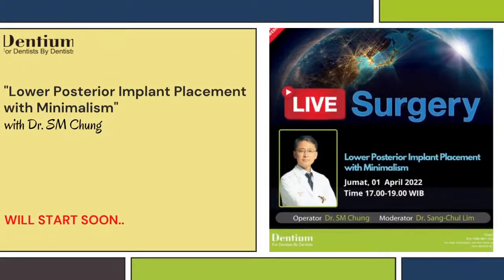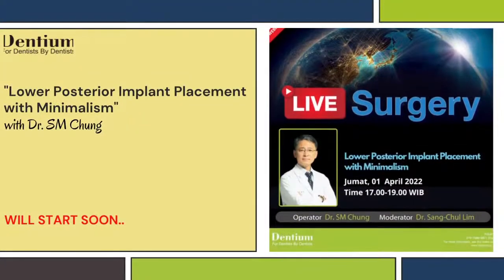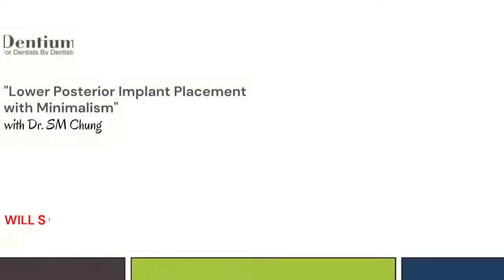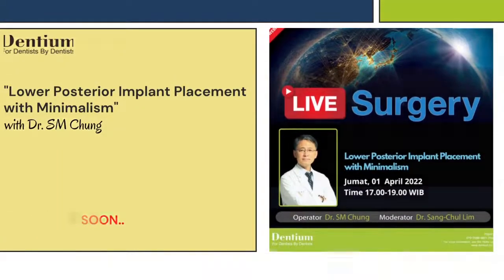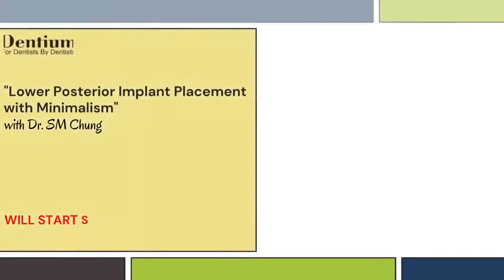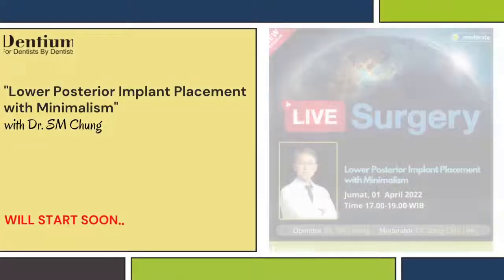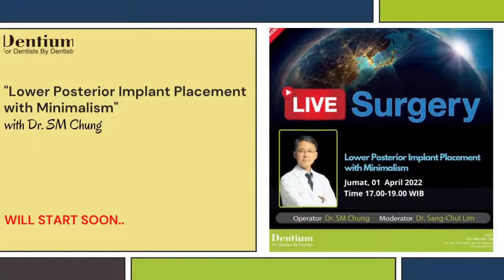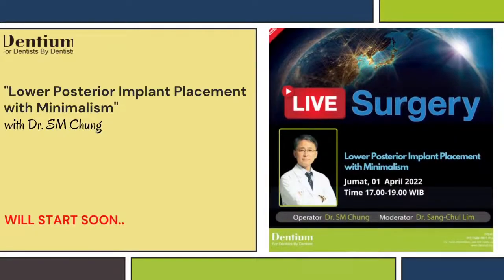He's going to have flapless surgery. After making the insertion point, he changes to the Lindemann drill first, and the Lindemann drill until 11 millimeters.